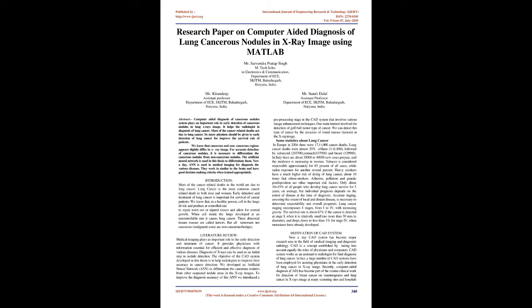We know that cancerous and non-cancerous regions appear slightly different in an X-ray image. For accurate detection of cancerous nodules, it is necessary to differentiate cancerous nodules from non-cancerous nodules. The artificial neural network is used in this thesis to differentiate them. Nowadays, ANNs are used in medical imaging for diagnosis of various diseases. They work similarly to the brain and have good decision-making criteria when trained appropriately.